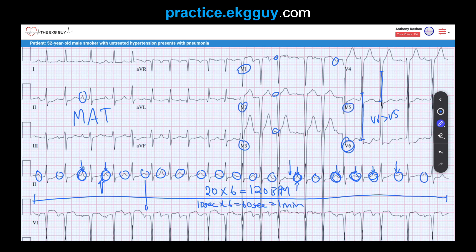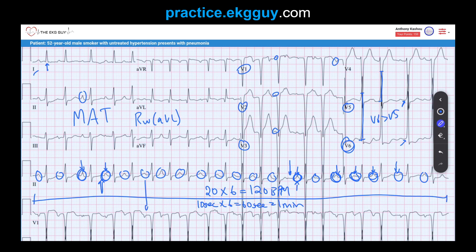Looking at V5 and V6, there is no Q-wave present, reassuring that LVH is present. There are many different criteria for LVH, and sensitivities are not very good for any of them. The Cornell criteria tends to be the most accurate. That involves taking the R-wave in aVL and adding it to the S-wave in V3.